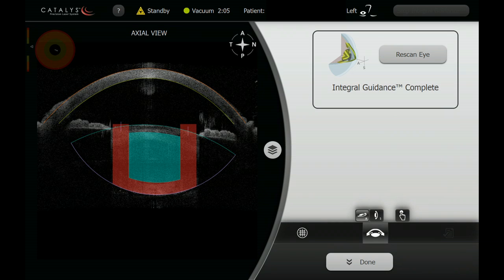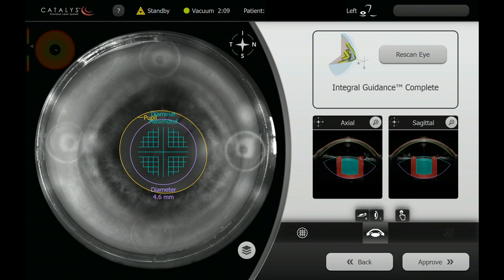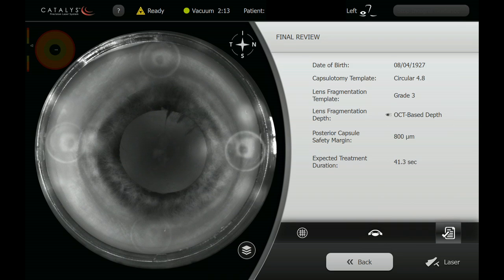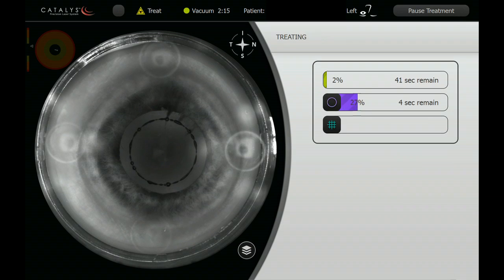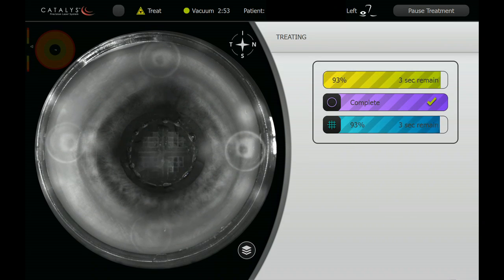Now we are going to check axial and sagittal views for fits of surfaces to the cornea and lens. We can see that the pupil is still outlying appropriately, and therefore the patient has not had any significant movement. Capsulotomy is applied in an efficient manner, and then the lens cuts, fragmentation, and softening are applied as well.